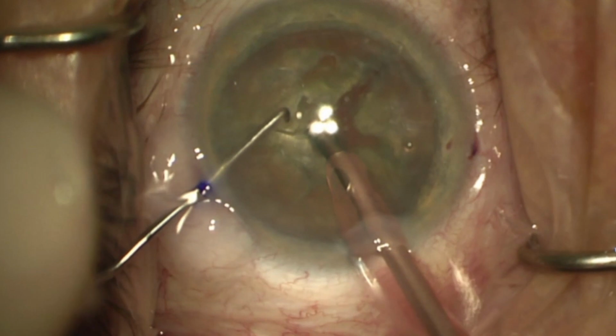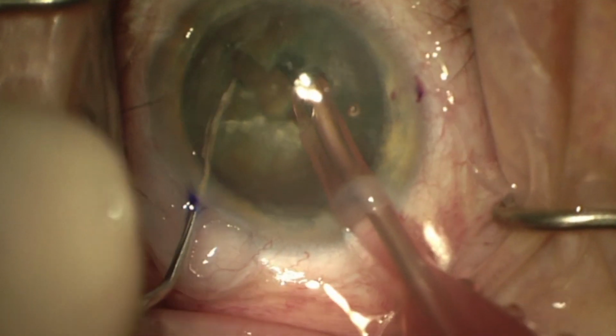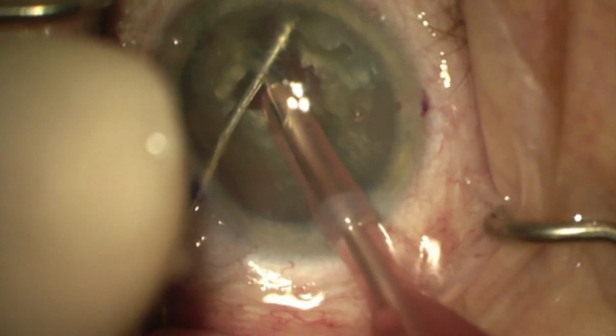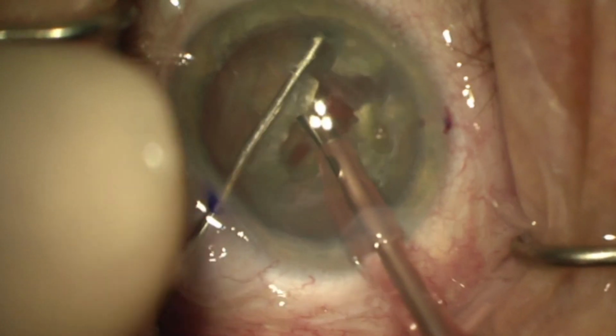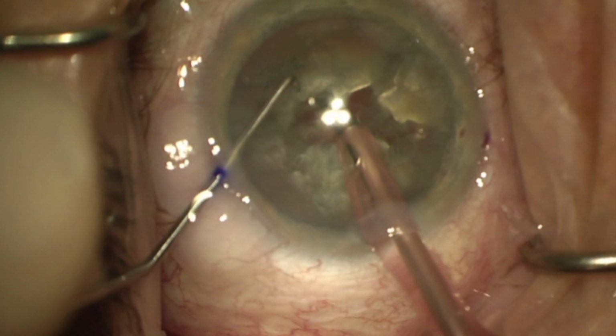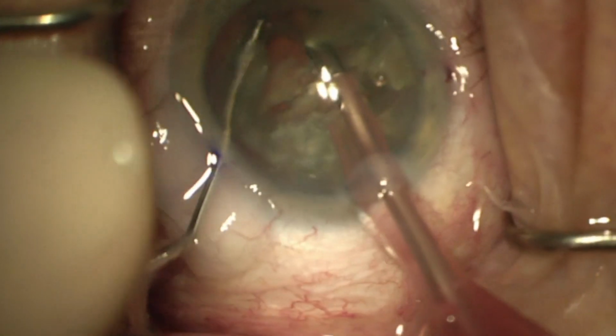So it's not only coming down, there's a bit of coming up after you have a good purchase on the nucleus with high vacuum. This is a vacuum of 500 millimeters of mercury on the Constellation, and aspiration of about 40 cc per minute. And here, just keep going.